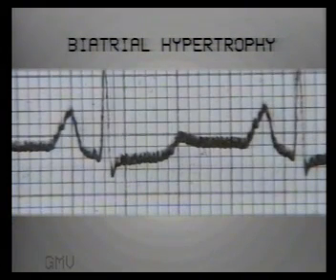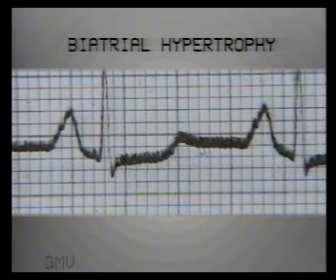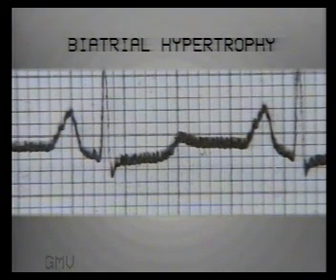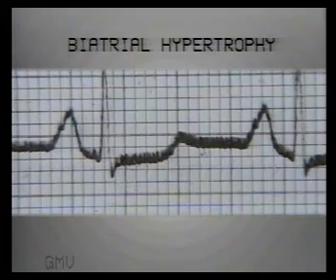If both atria are hypertrophied, the P wave in lead 2 will be both taller than 2.5 small squares and broader than 2.5 small squares. This ECG demonstrates biatrial hypertrophy.